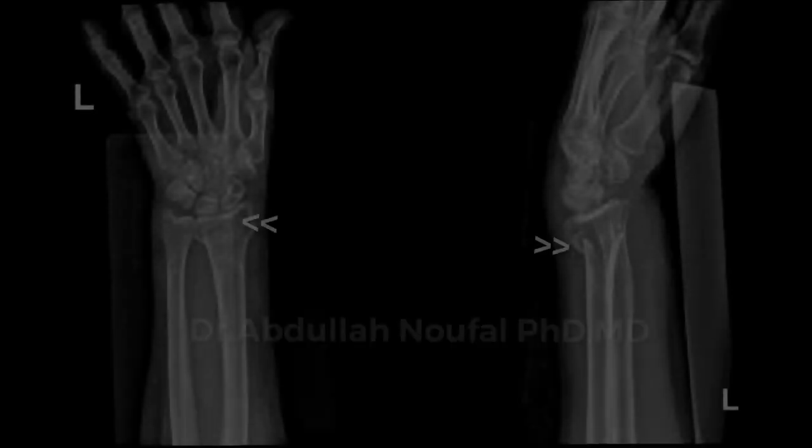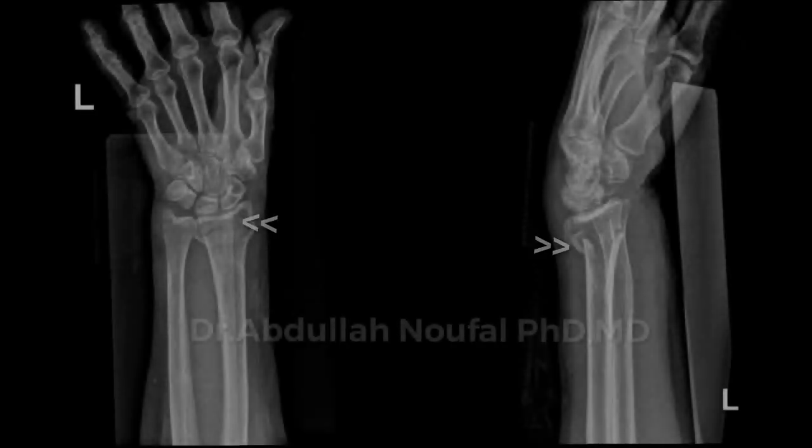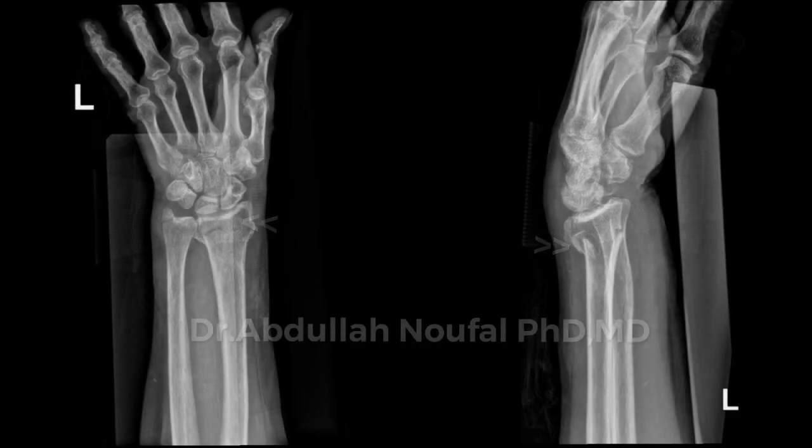In this part, we will discuss a very popular case, which is the distal radius fracture type Colles fracture. It's by definition the posteriorly displaced extra-articular fracture of the distal radius. The patient is a 67 year old female, came after falling on an outstretched arm, complaining about swelling with the typical dinner fork deformity. This case was treated by closed reduction and K-wire fixation.